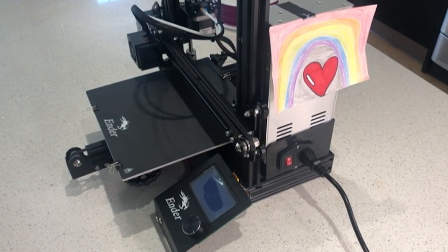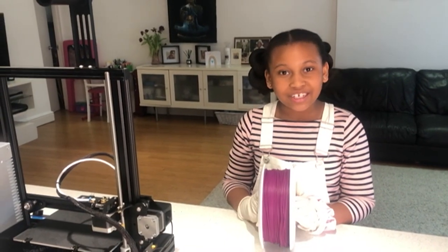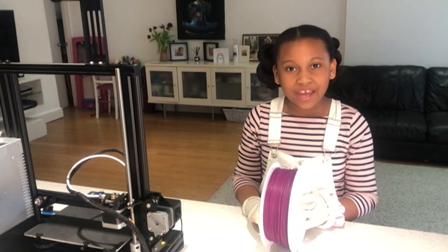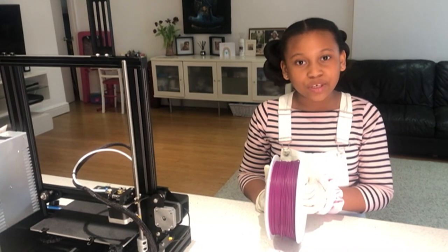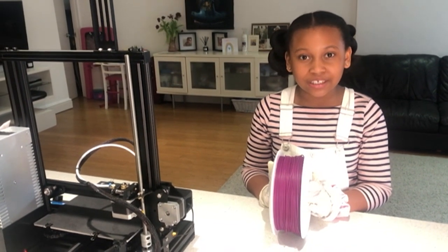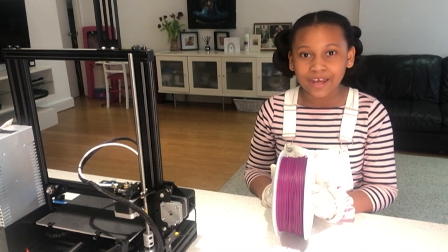Firstly, start by turning on your 3D printer. Since I have already been making these masks, I have already uploaded my visor file onto my 3D printer. That file is called a gcode. Next I'm going to get my PLA filament. The PLA filament is what we use to make the headbands out of. The reason we use the PLA filament is because it is biodegradable, which means that it is not harmful to our planet.